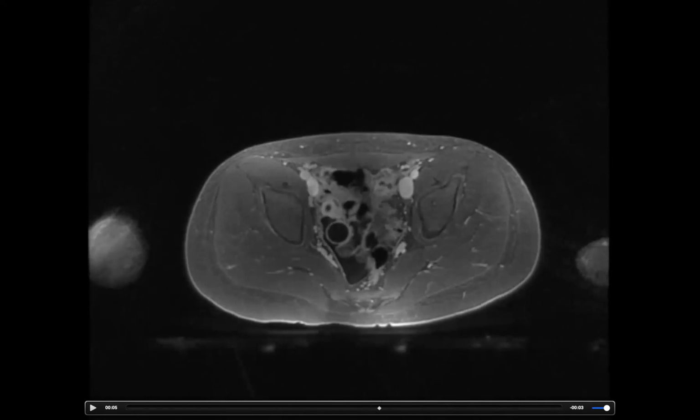So what's on the bottom, folks? Is it the table? Yeah, table or even the receiver coils. Yeah, table and receiver coils. And so we're imaging solids here, right? Because the echo time is so short that you can image that.